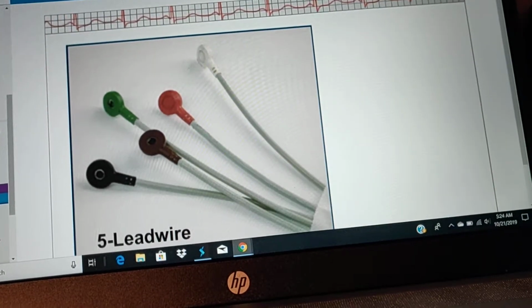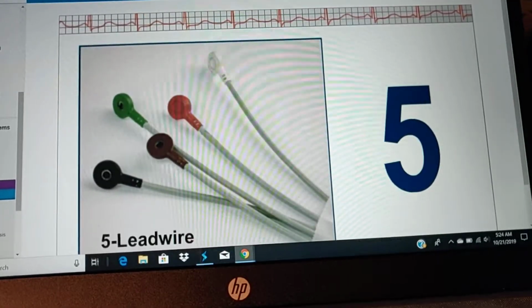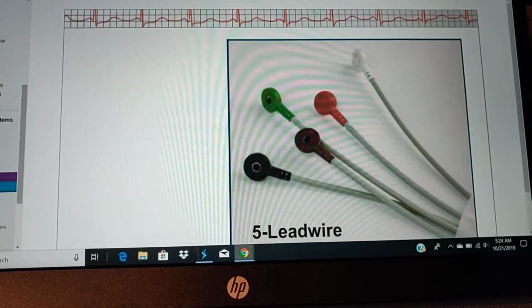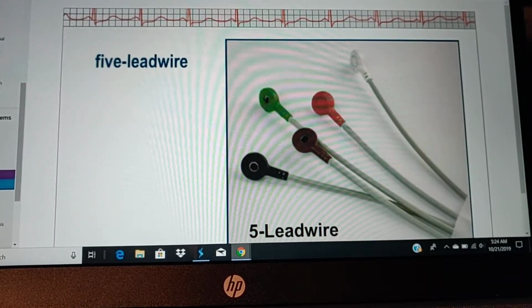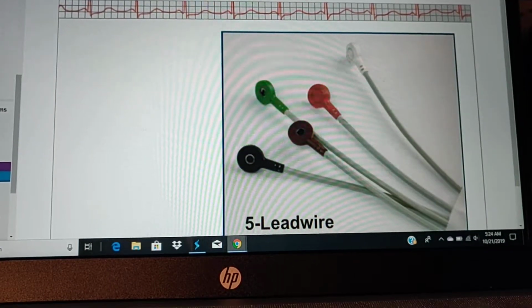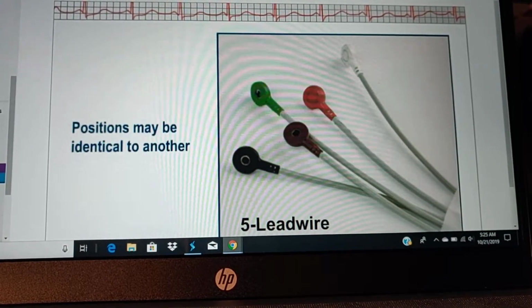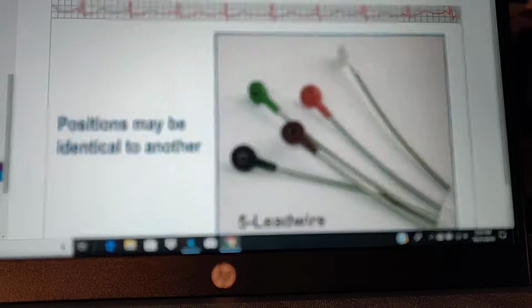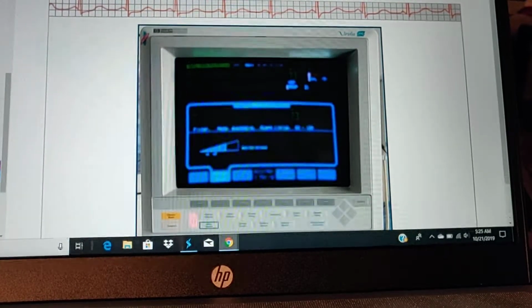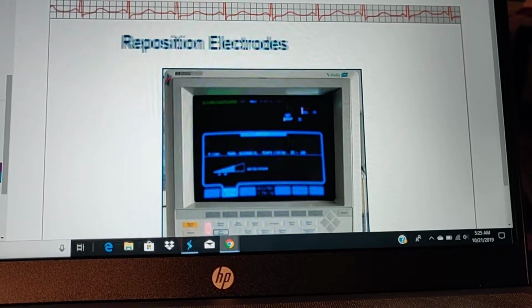ECG testing can be done with 3, 4, or 5 electrode systems, all of which are grounded to block the patient from being electrically shocked by the equipment. Today, you will likely encounter 3 lead wire, 5 lead wire, and telemetry monitoring systems. When working with the 3 and 5 lead wire apparatus, you may encounter electrode positions for one lead that are identical to another. Simply change the lead selector to the appropriate corresponding lead. You might have to reposition the electrodes when this situation occurs.